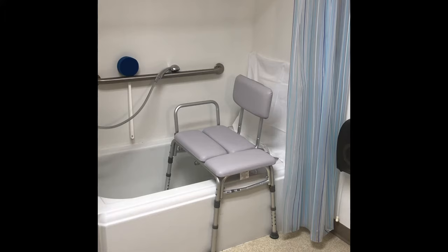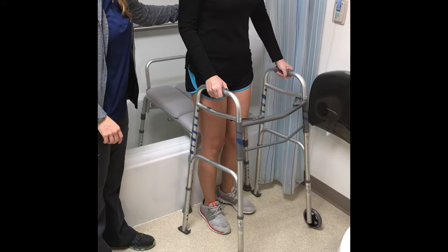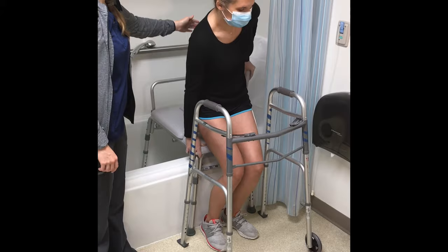For this demonstration, the patient had her left hip replaced. Walk up to the bench with your walker, then turn with the walker and reach back for the bench to slowly lower yourself into sitting.